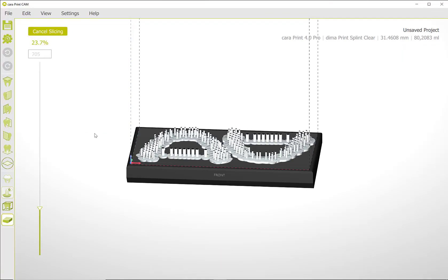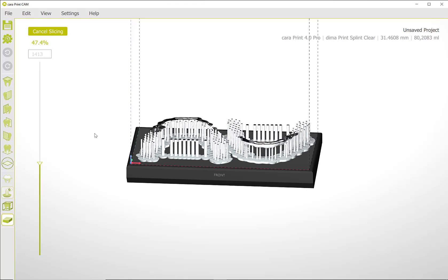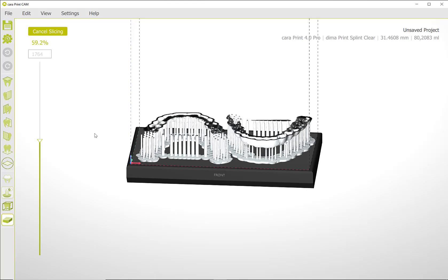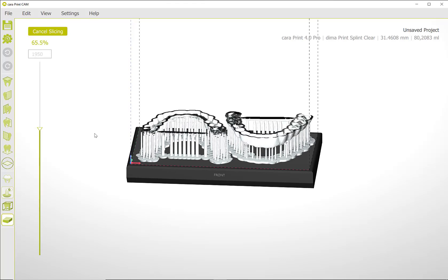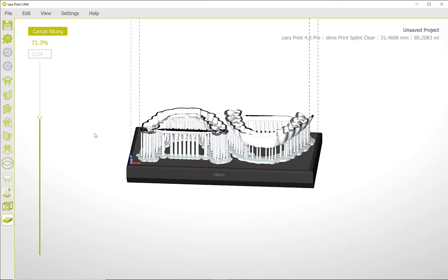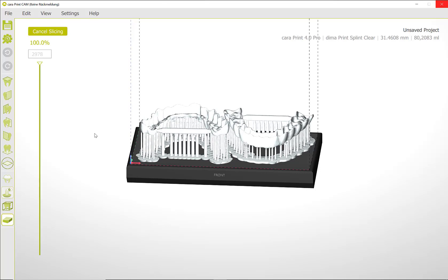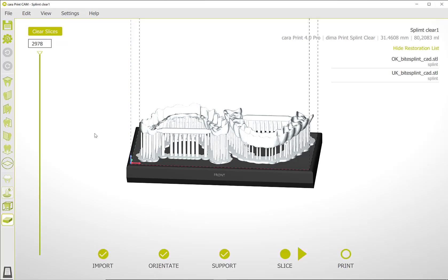During the slicing process, you can follow the progress on the screen. Once the process is complete, you can transfer the sliced file to the printer. This can be done via USB stick or directly from the software via your network.